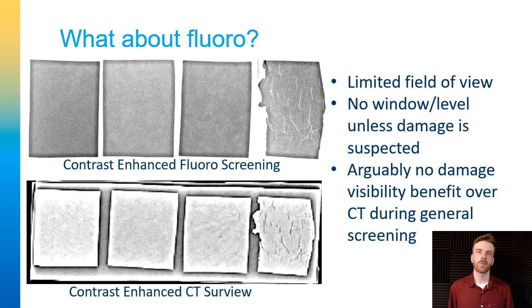but I couldn't do the same standard deviation measurements on the exported fluoro images that I did on the CT images because the field of view was so small that I had to image each sample individually, which meant each sample had different technique factors due to the automatic brightness control, and the standard deviation values wouldn't be as comparable.